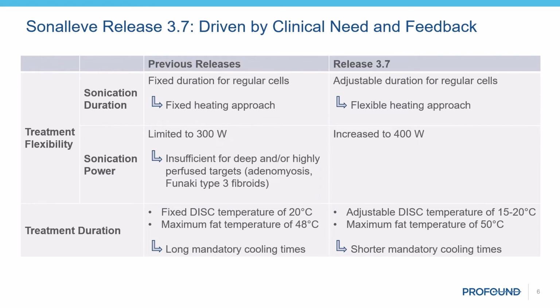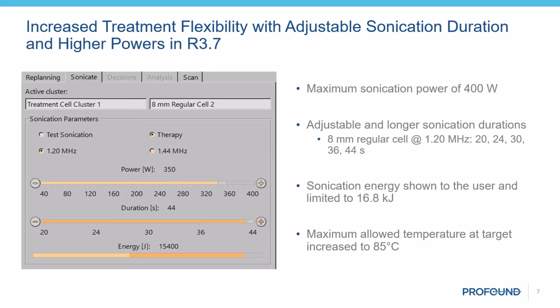Moreover, the efficiency of the disk was improved so that the actual water cooling temperature can now be adjusted down to 15 degrees Celsius. This should yield a further reduction in treatment duration due to decreased cooling times. The higher flexibility in choosing longer sonication durations and higher powers also affected the user interface of the Sonalleve software.